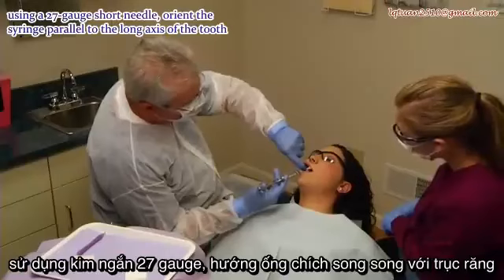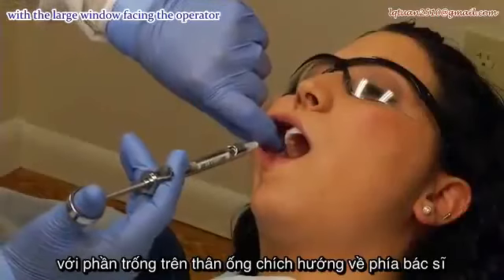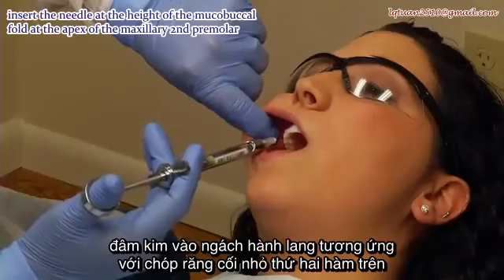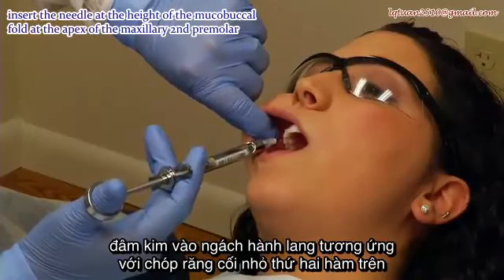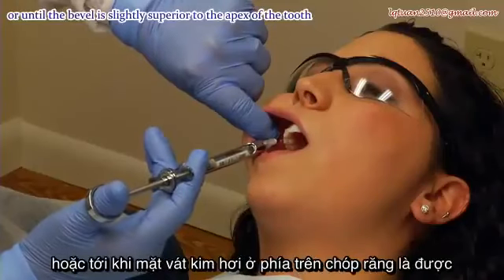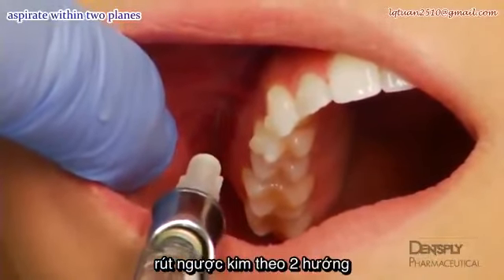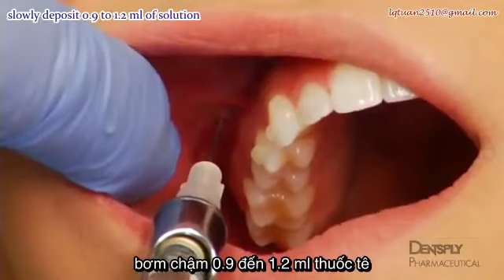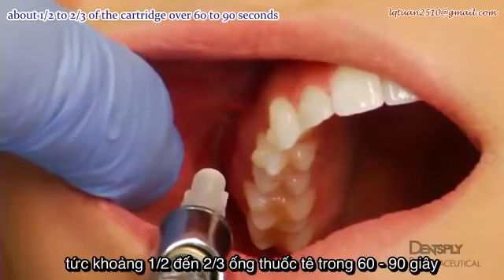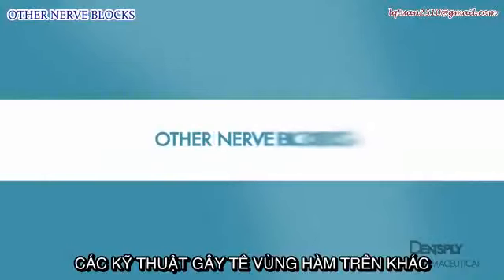Using a 27-gauge short needle, orient the syringe parallel to the long axis of the tooth with the large window facing the operator. Insert the needle at the height of the mucobuccal fold at the apex of the maxillary second premolar, approximately 1/4 of the depth of the short needle, about 5 millimeters, or until the bevel is slightly superior to the apex of the tooth. Aspirate within 2 planes. Slowly deposit 0.9 to 1.2 milliliters of solution, about 1/2 to 2/3 of a cartridge, over 60 to 90 seconds. Other nerve blocks.